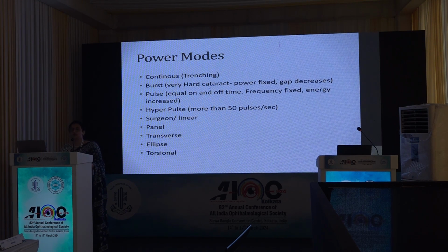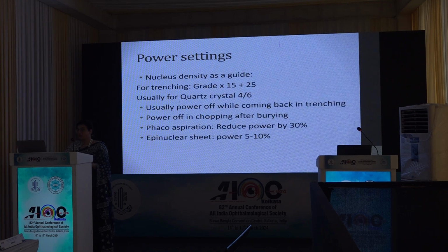Surgeon or linear mode, as we press the pedal, the power increases. There is a panel mode, transverse mode, ellipse mode. In newer machines there is also a torsional mode. So with longitudinal there is a transverse side to side angular action. For power settings, a rough guide used for trenching is the grade of the nucleus into 15 plus 25. This is for quartz 4 to 6 crystals. So if there are fewer crystals, we have to increase the power.